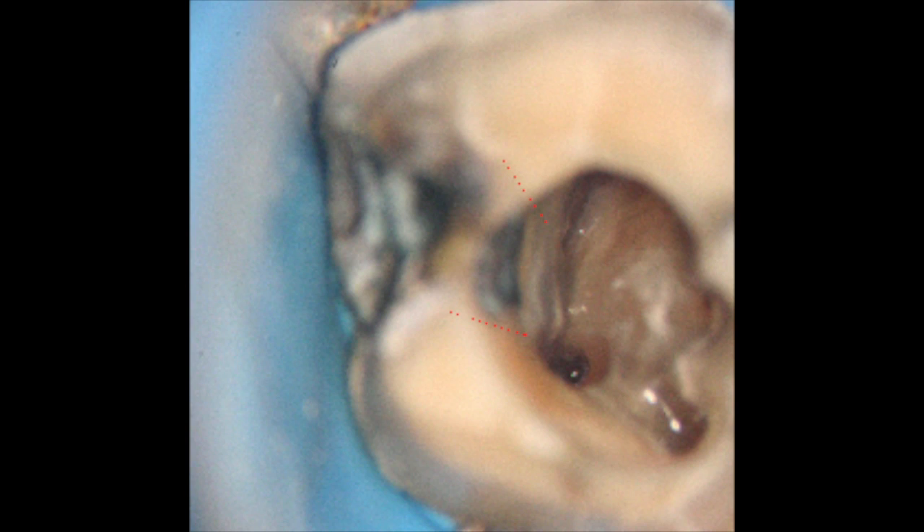I found the DB2 by troughing a white line connecting the DB1 and the palatal canal. When I got down a few millimeters in the trough, I found a white dot. Negotiation required a very small flexible instrument at first. Here is the finished cleaning and shaping with a paper point joining through the DB2 through the DB1.